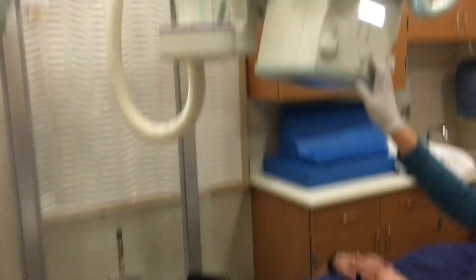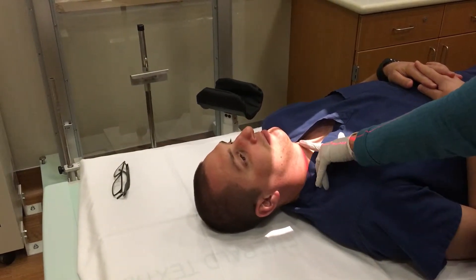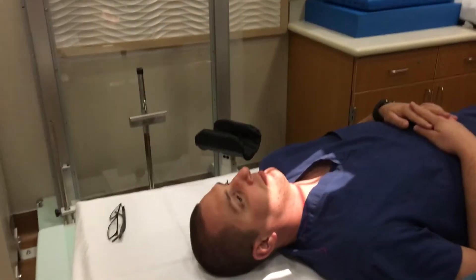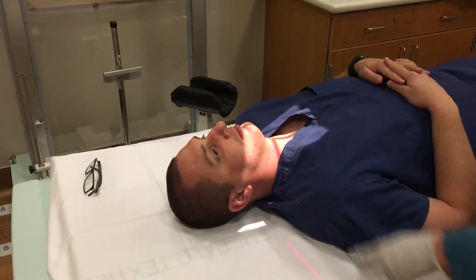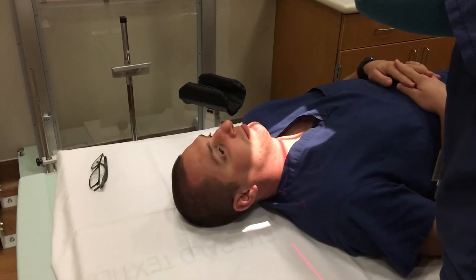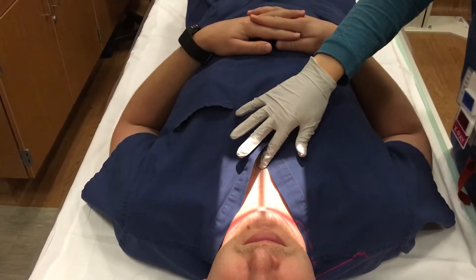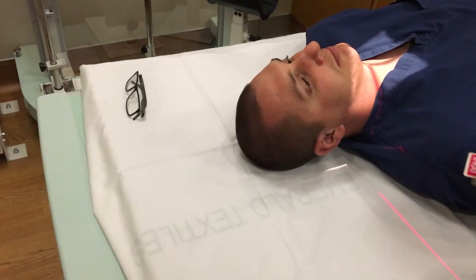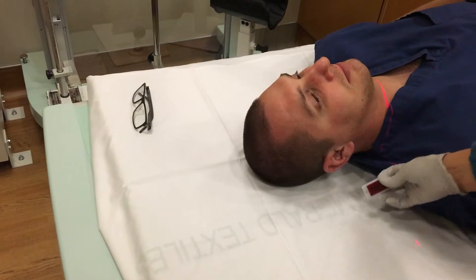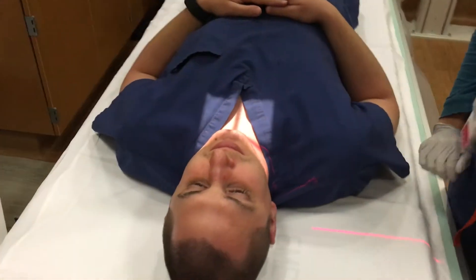Then you're going to line up your light so that you're entering at the thyroid cartilage, which is at C4. You're going to collimate your light so that it's just above the chin and then a little bit below the manubrium. You want a little bit of light on your side so you can put your marker right there. And that would be your AP position.